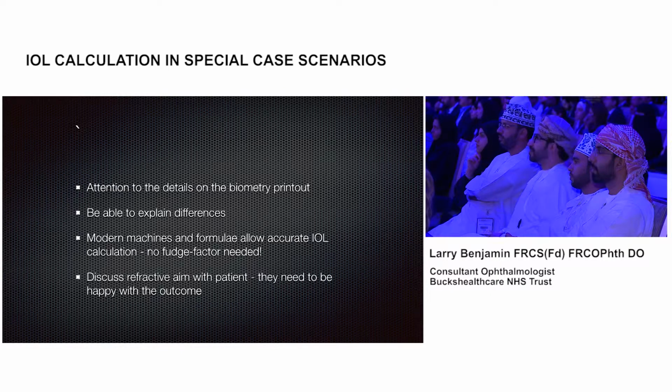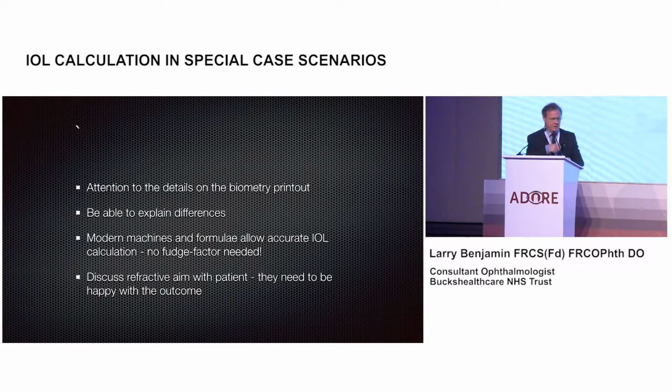But modern formulae do allow you to choose the closest to zero that you can, and make sure you discuss the refractive aim with the patient, because they're the ones really at the end of the day that need to be happy with the outcome.